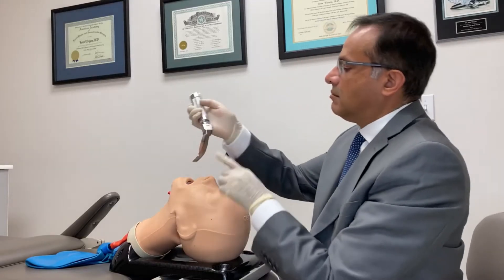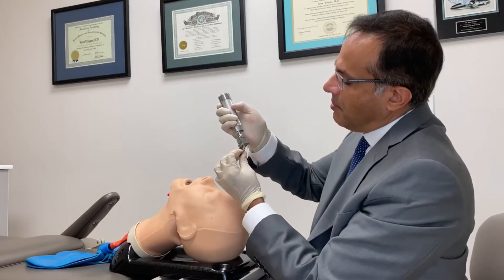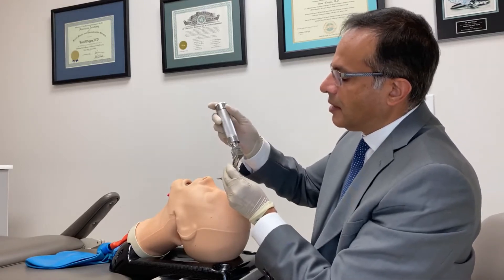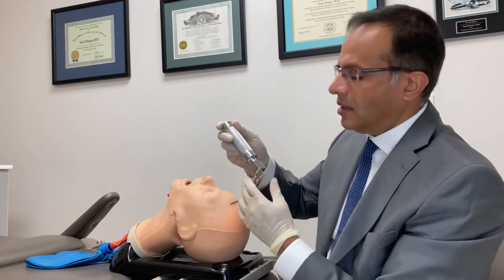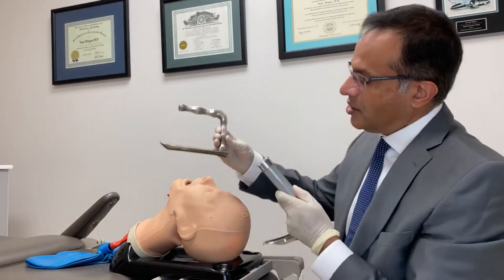I would contend that this high profile and metal construction is the number one reason why there are so many dental injuries when intubating — which is completely different from how we intubate using the v-scope or the anterior commissure scope.